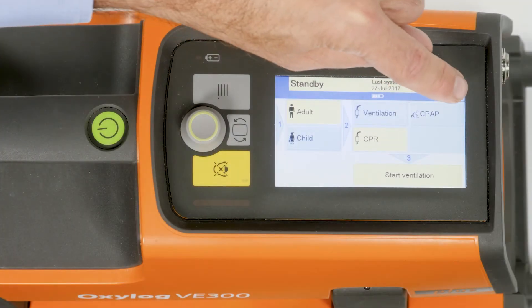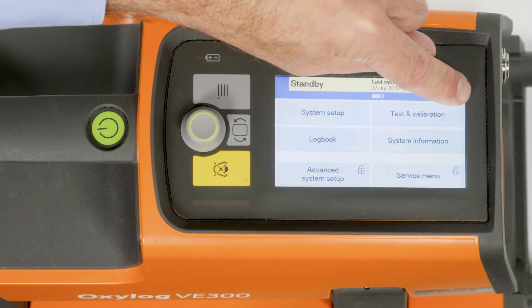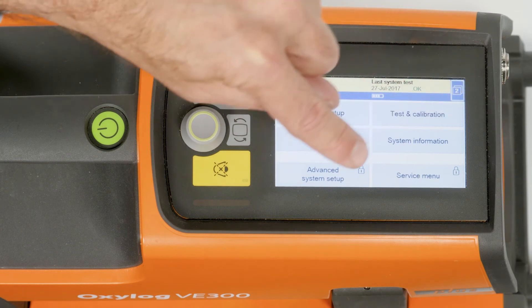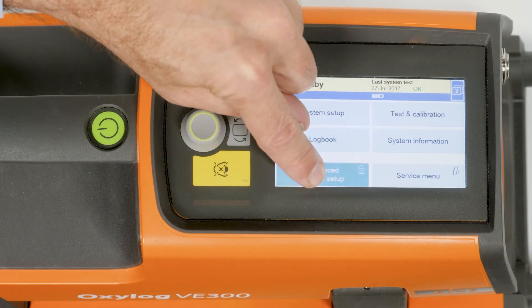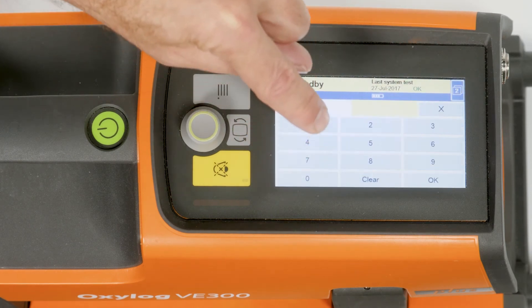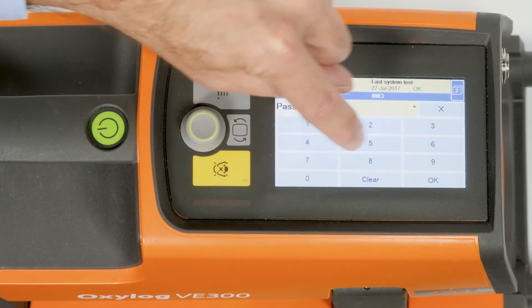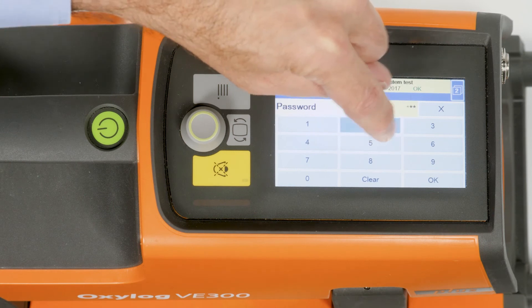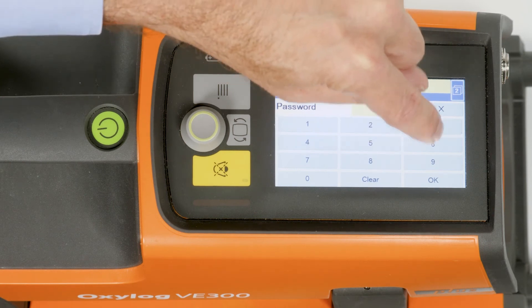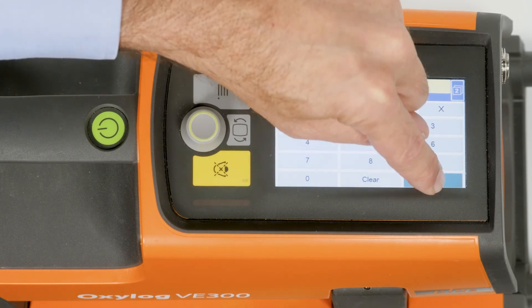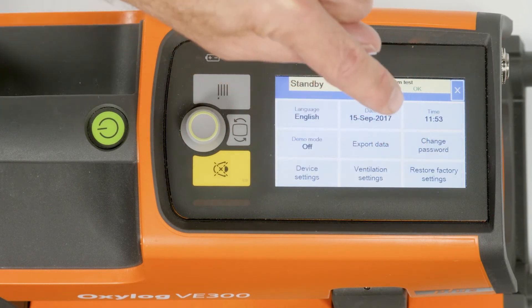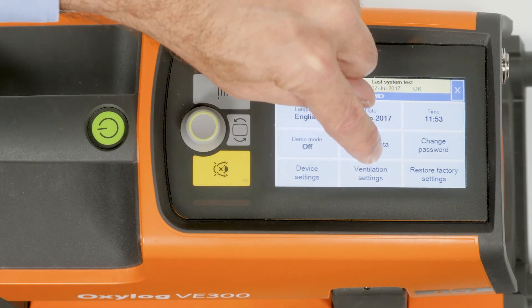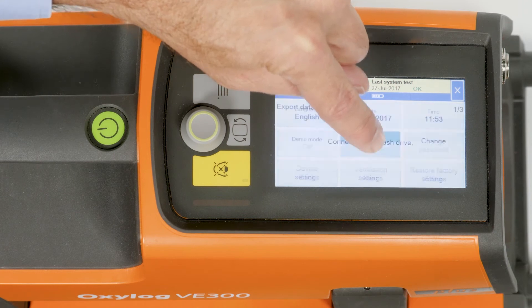System tests, screenshots, and patient log data can be exported as a log file to a USB flash drive for analysis and documentation purposes. To export log files, touch the Export Data button.